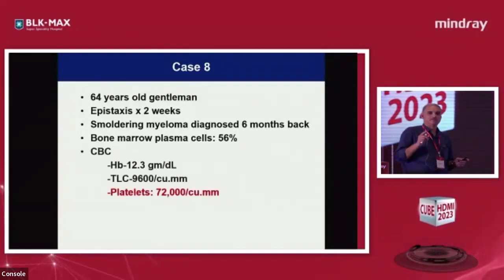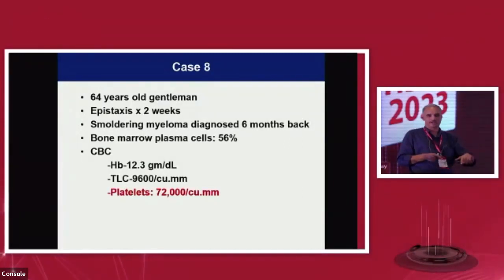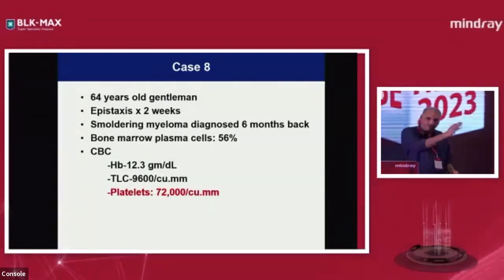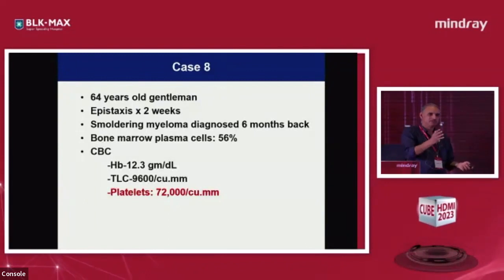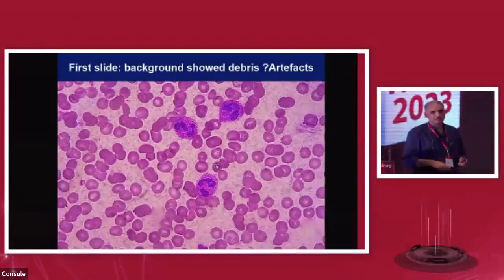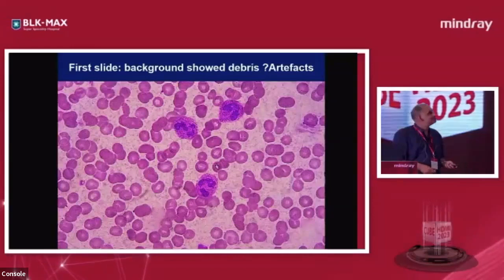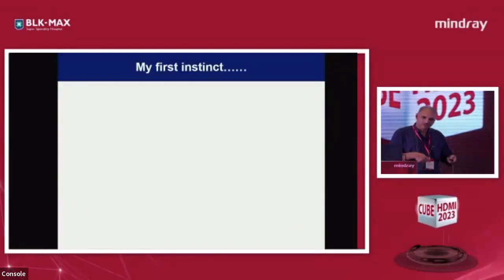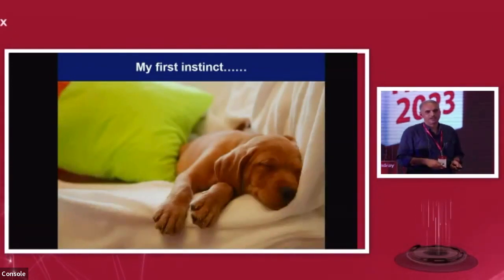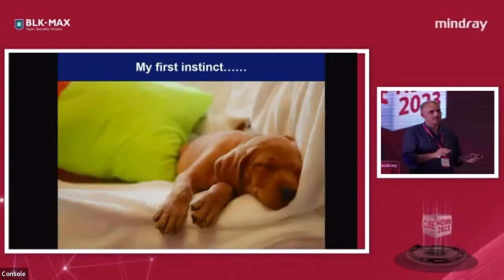Now patients are clever sometimes. He had a previous report of a platelet count from outside the same day, which he did not show us at that time. So our platelets were 72 and we thought, elderly, maybe an element of MDS setting in, or the malignancy, because he was not on any treatment, that could explain. Anyway, that is what his smear showed. Neutrophils, RBCs, it's a dirty slide, I agree. My first instinct was to report this off, go home, relax. I was just plain lucky that I decided, okay, let me make one more smear. I had no clue what was coming up.